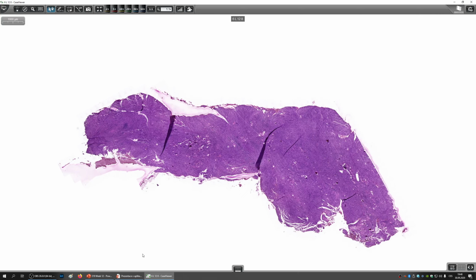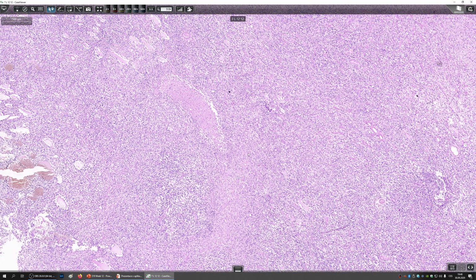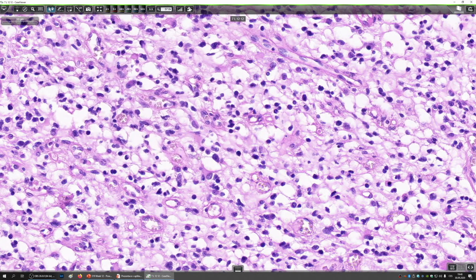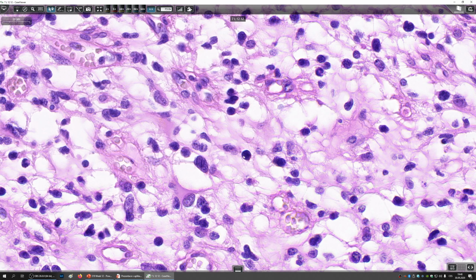Let's check it out in histology. Here we have a big tumor. This was probably an autopsy finding because everything is tumor here, everything is neoplastic. So I will just describe it briefly. So it consists of a single monomorphic population of glial cells. There's only slight atypia.